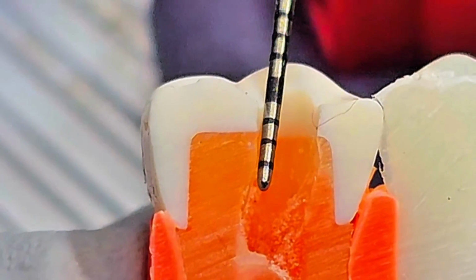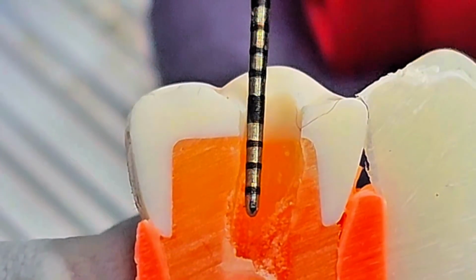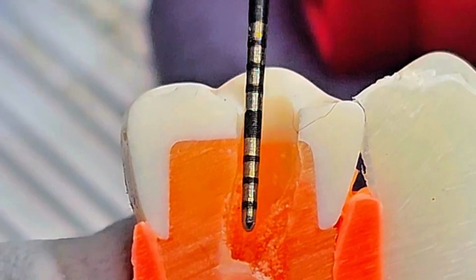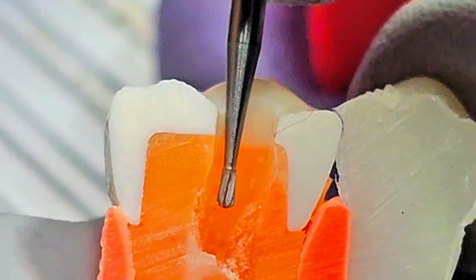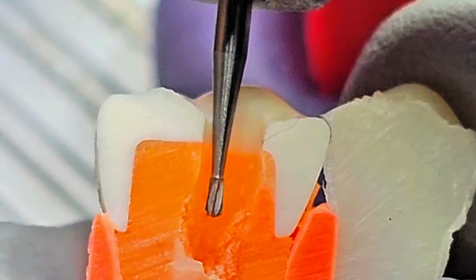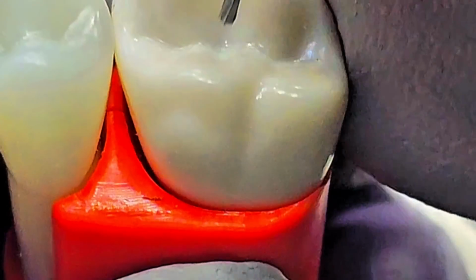From the denting, you need to go all the way down about 1, 2, 3, 4, 5 millimeters. So keep going until 5 millimeters. For that, you need to know how to approximate the depth on the length of your burr. If you are using a 330, then probably about this much. I'm going to begin the access prep with the 330, but any burr is fine.